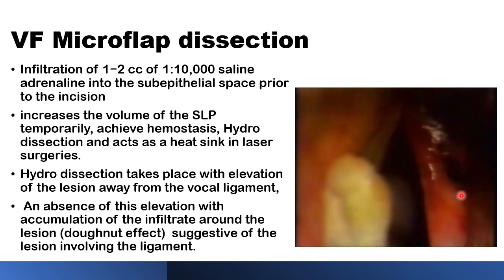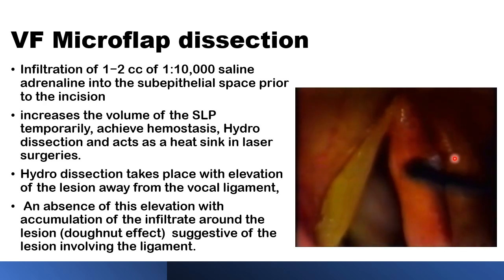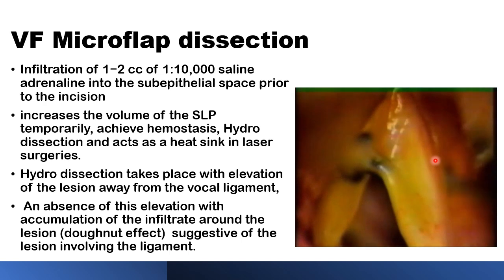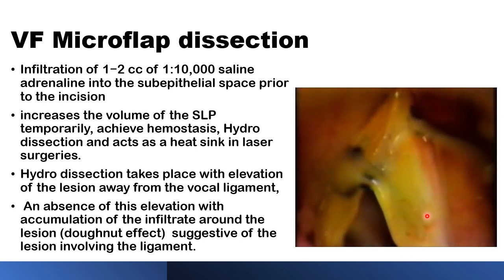Care must be taken not to injure the vocal ligament. The vocal ligament injury would induce fibrosis, and this ultimately is going to cause vocal fold stiffness. This is the vocal ligament, the whitish structure in there.